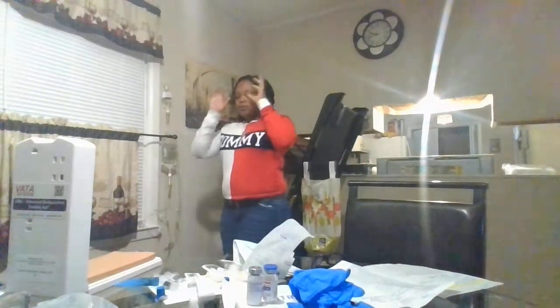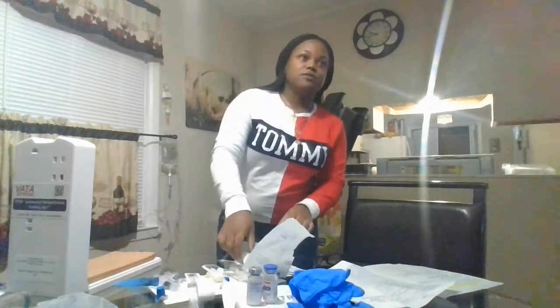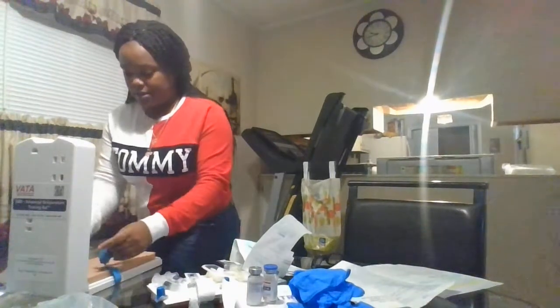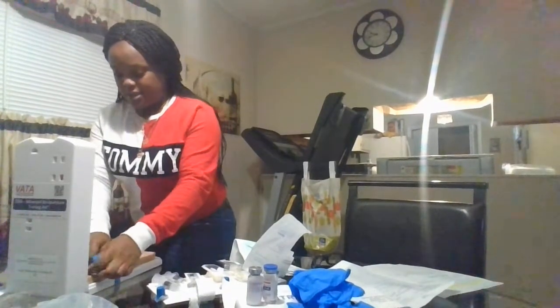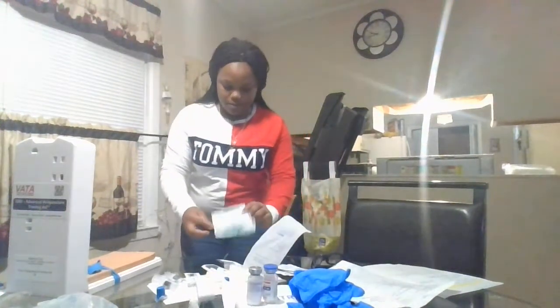Okay, putting on my goggles, washing my hands, and I'm going to put on my sterile gloves. Okay, before I do that, sorry, wash my hands again. I'm going to apply my tourniquet so we can get that vein to pop up. Perfect. Wash my hands.